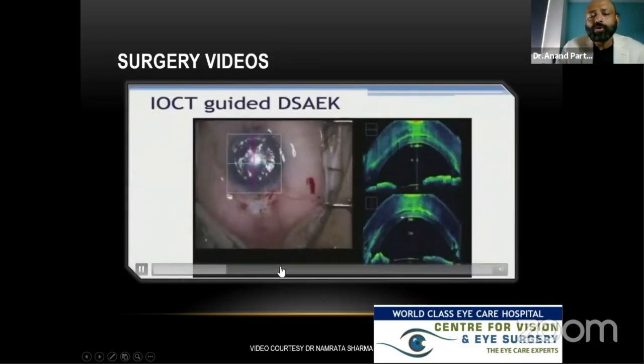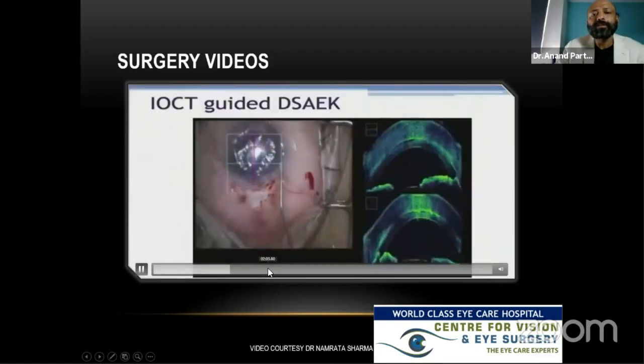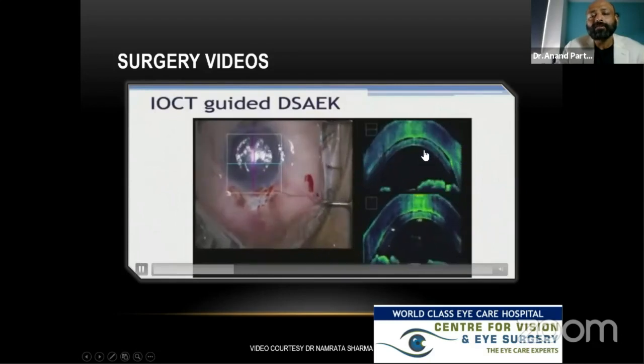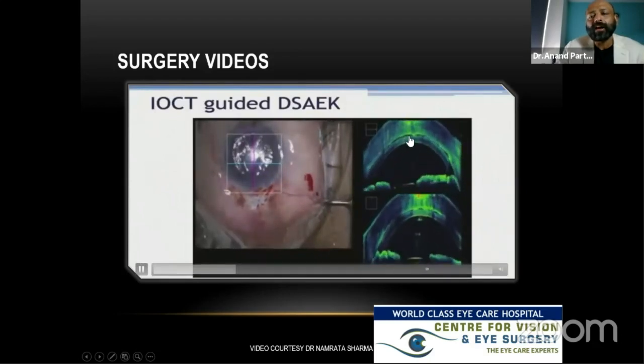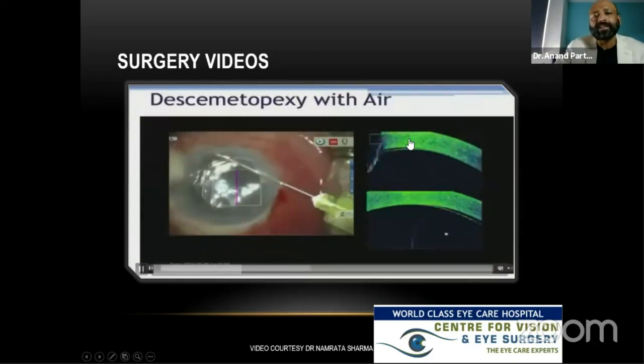So I usually do paracentesis, basically full thickness corneal incisions on the recipient stroma, and you can actually, even when you're injecting air, see that the graft actually moves. So you got to make sure that all these water clefts are clear on table. So you might take 5–10 minutes extra.